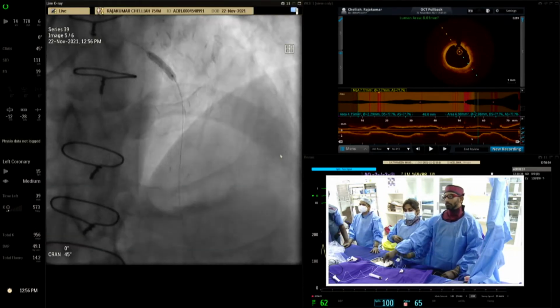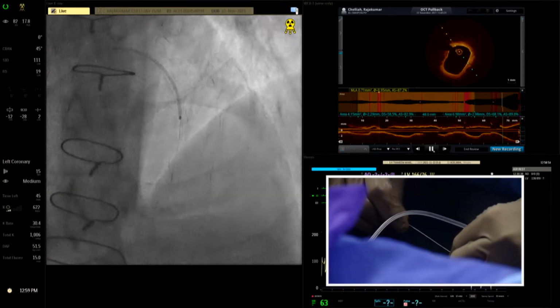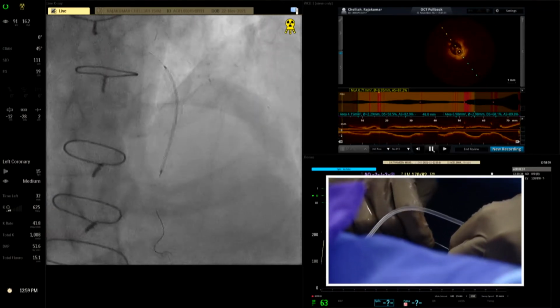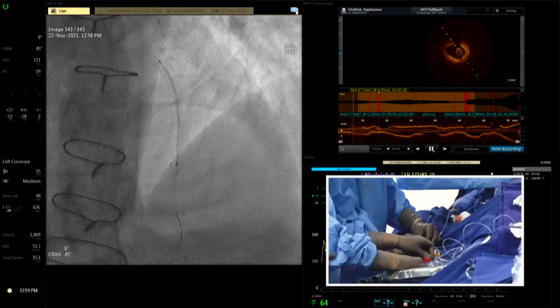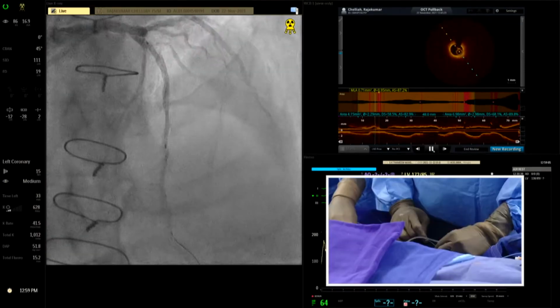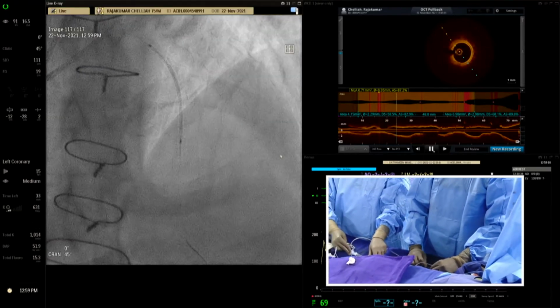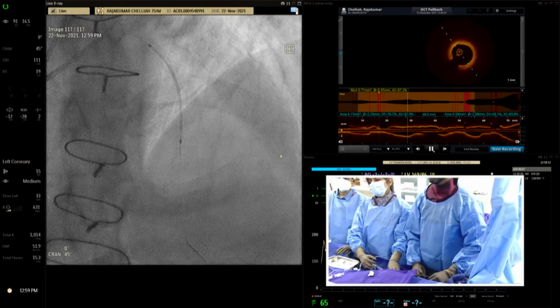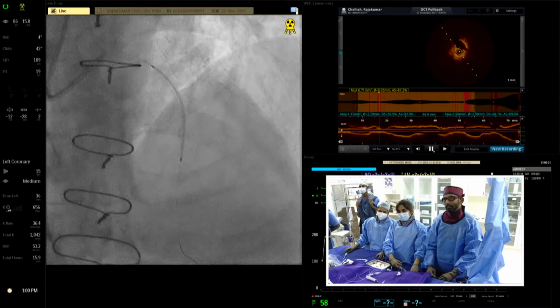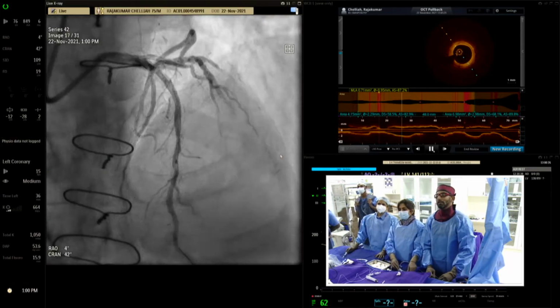Down. Just gentle breathe in, sir. Okay, breathe normally. So you can see that the stent is, yeah, I'm just pulling back. Yeah, more. Okay, we'll take a picture and see whether. Back, yeah, come back, yeah, that's fine. Okay. Take a cine there. Yeah, that's fine. Come back to cranial. We'll see. Make sure we are covered in the cranial.